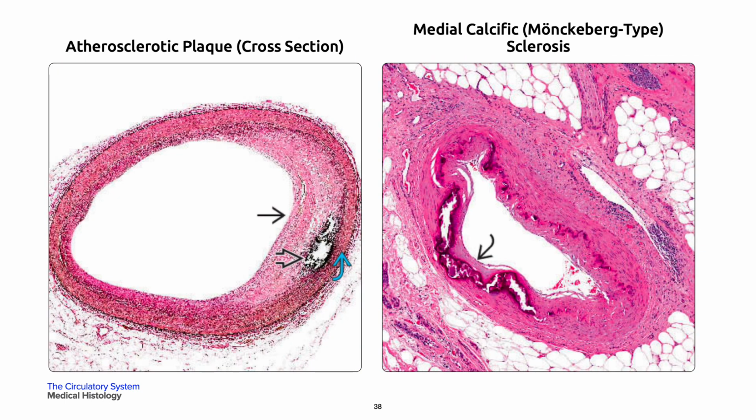On your left is an elastic staining of this muscular artery showing the atherosclerotic plaque. This is in a single black arrow in the intima inside the internal elastic lamina. The atrophy of the underlying media (curved blue arrow) and focal calcification (bold black arrow) are also seen. On your right is a paraffin section of the muscular artery showing the extensive calcification (curved black arrow). These are centered on the internal elastic lamina, and this is largely an age-related phenomenon and of no major clinical significance.